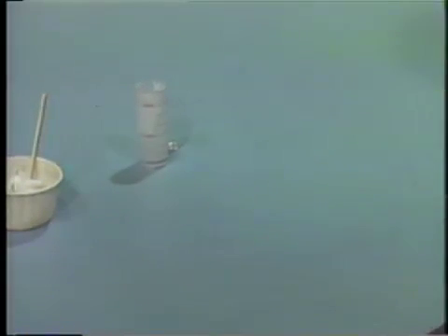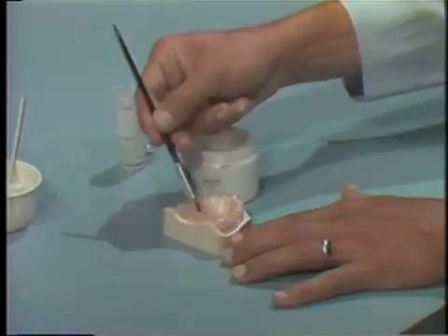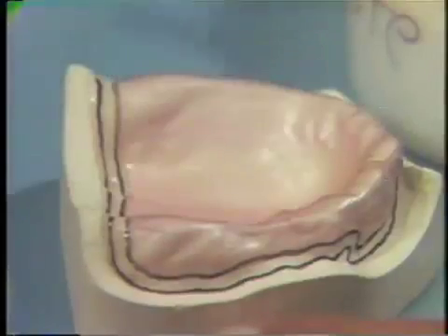While it is setting, paint the diagnostic cast with liquid foil substitute. Apply it only to the surface of the stone, not to the surface of the wax. The liquid foil substitute will enable easy separation of the impression tray from the diagnostic cast.